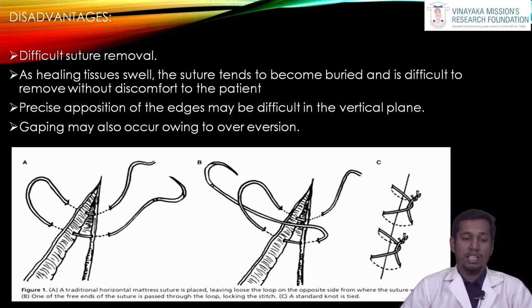But again, as a disadvantage, there will be discomfort to the patient during suture removal. Precise apposition of the edges may be difficult in a vertical plane, and gaping can occur in between the sutures, which is very much considered a disadvantage of this suturing technique.